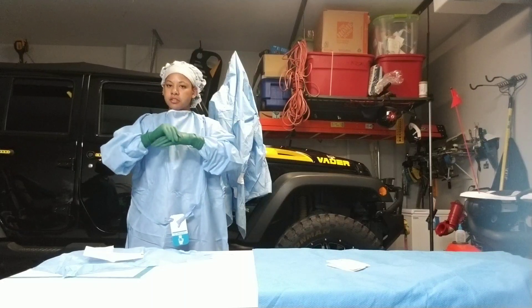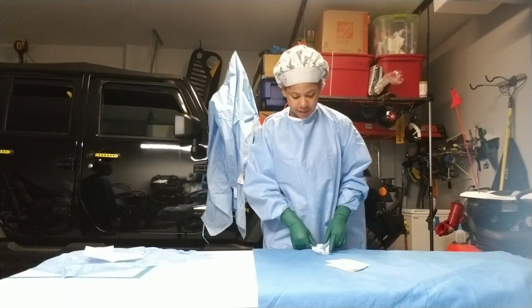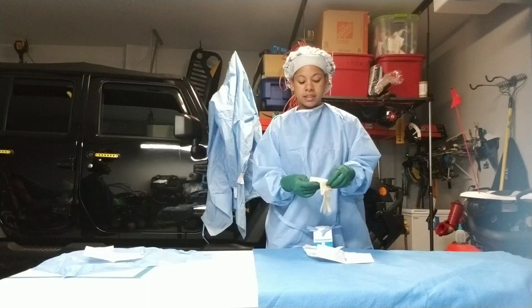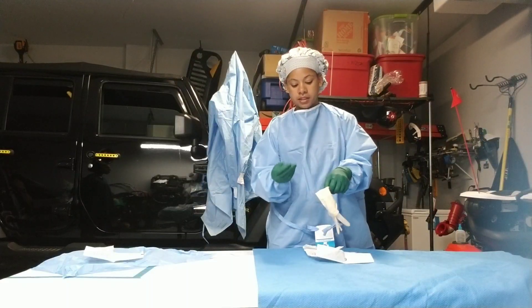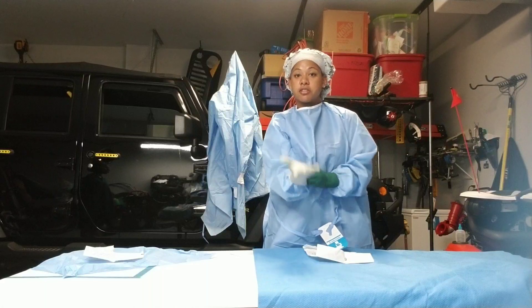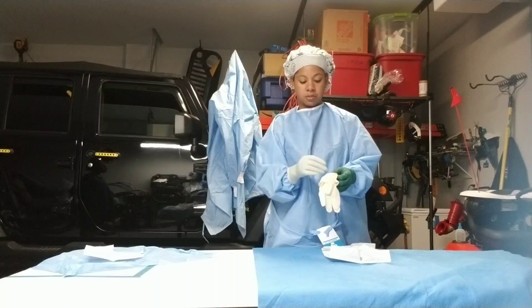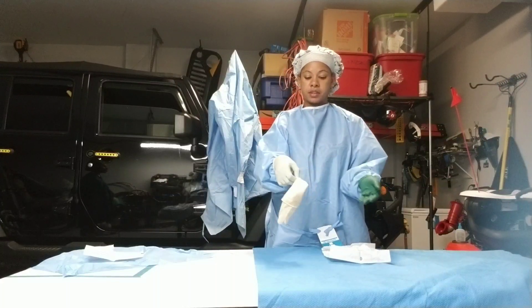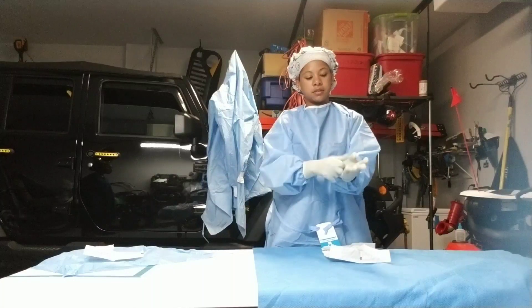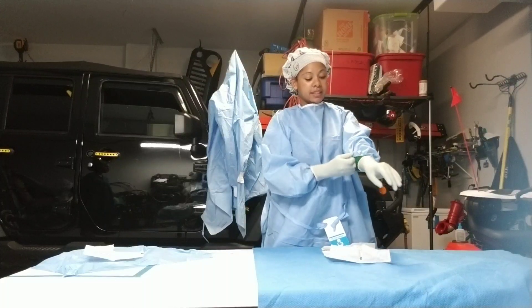Sometimes you don't dry all the way — it gets a little difficult, that's fine. Now you're going to walk over to your sterile back table and put your card on top of the table, then put your second pair of gloves on. For me, it's easy to do it the way you would open glove: I hold it, stick my pterodactyl in, and slide my fingers in. Being that you already have sterile gloves on, it doesn't matter what you touch — there's no unsterile or sterile part when you're gowning and gloving. Same thing: pterodactyl inside the glove, adjust my fingers, pull it down, nice and comfortable, making sure that the white of my gown is not showing. I like to keep it above my wrist.